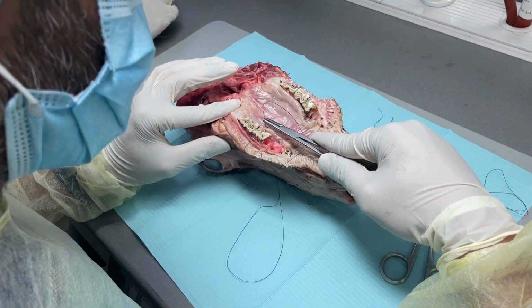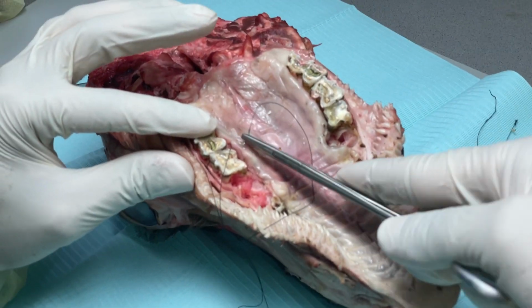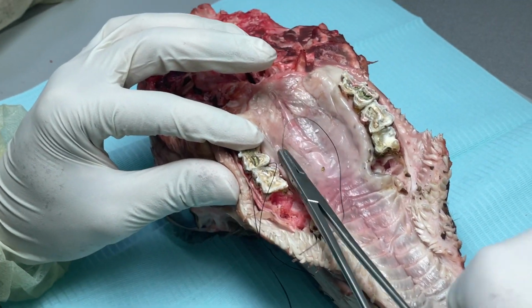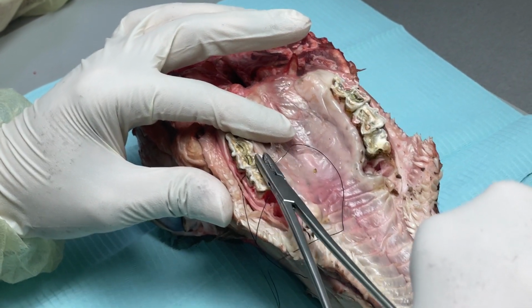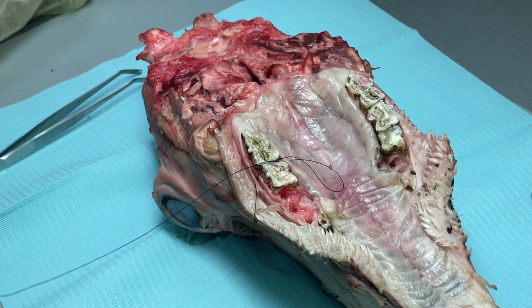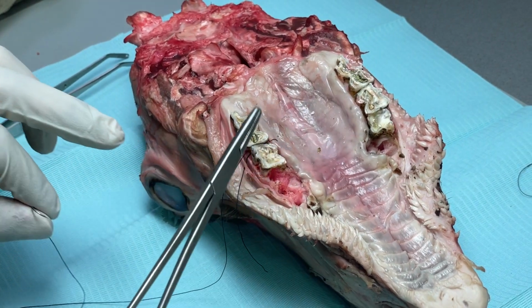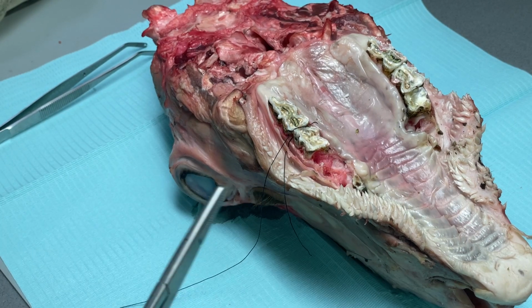So I will take a bite from here, from the external surface. This is a bit thick tissue, better if you use this one. And knot again on the buccal. For the knot again I have to pass it interdentally. It should not come on the occlusal surface, but I'll just show you. It will come like this, and then I'll show you the square knot.